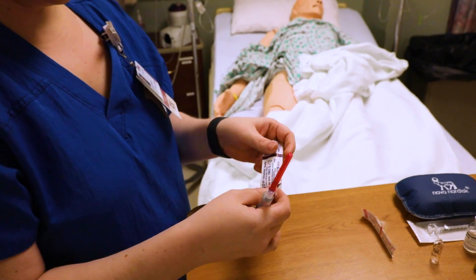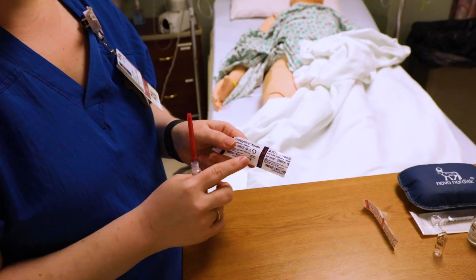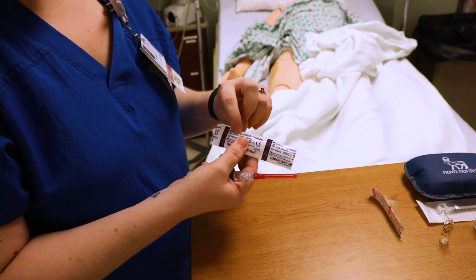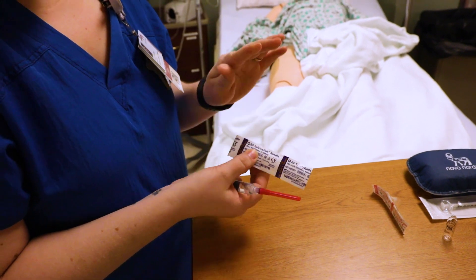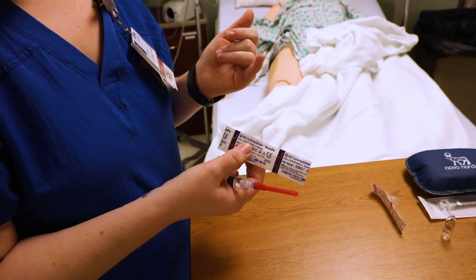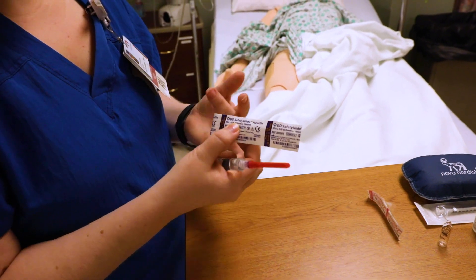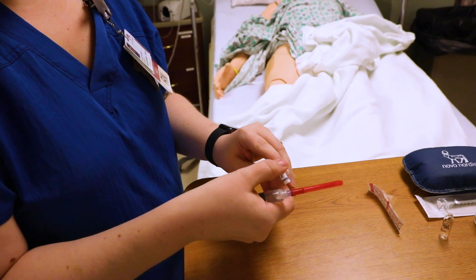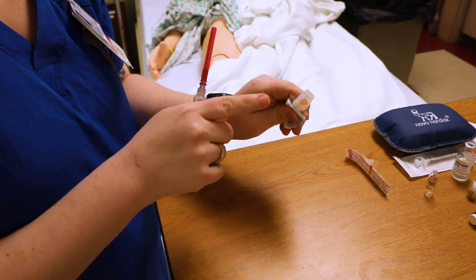Then go into your patient's room with this, and get your other syringe so you can change out from the blunt tip to a regular needle. Make sure you look at the right size and the right length — the gauge is how big the needle is and the length is how long it is. Make sure you get the right one for the type of medication you're giving, whether subcutaneous or intramuscular, and that it's appropriate for your patient. Open it up like so and make sure you don't touch anywhere there.